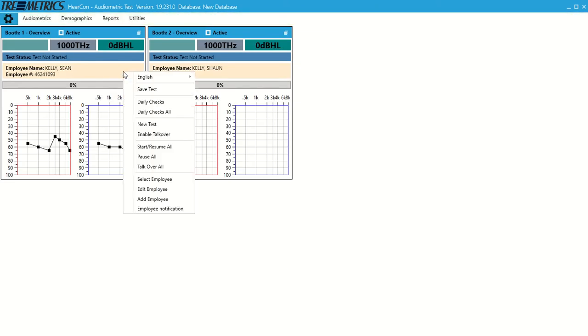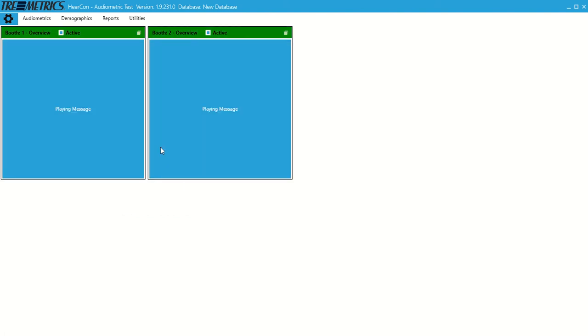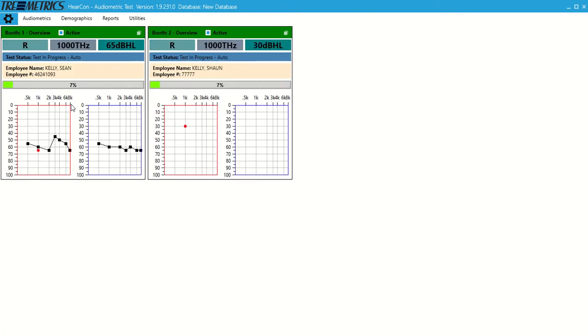Now we've got two employees in the booth. We can right click and do new test, which would be just for the booth we were hovering over. We could also do start resume all. Right now we have all the tests running at once, playing message. The RA660 does voice instruction in multiple languages. Right now it's playing the message: you're about to take a hearing test, press and release the hand switch. And now our test is starting.